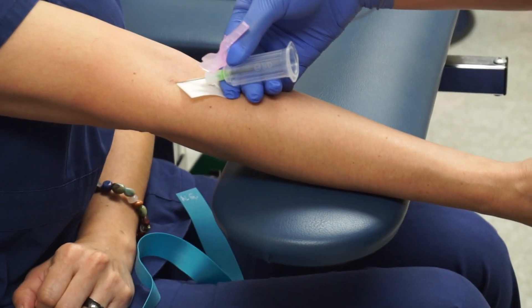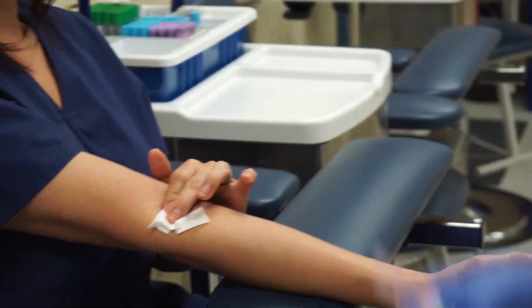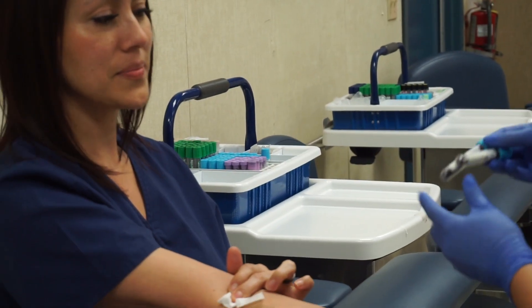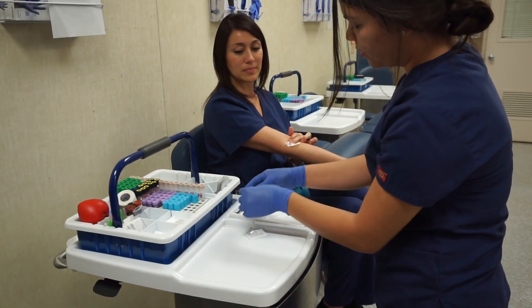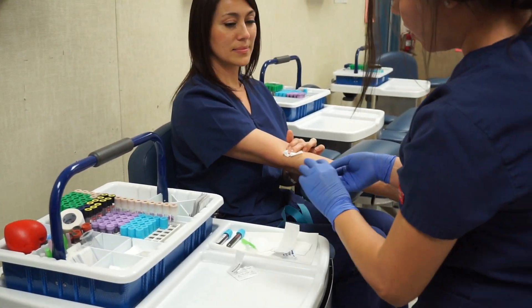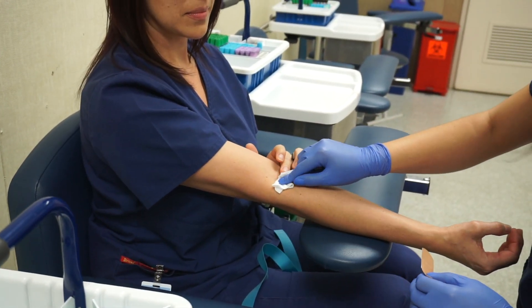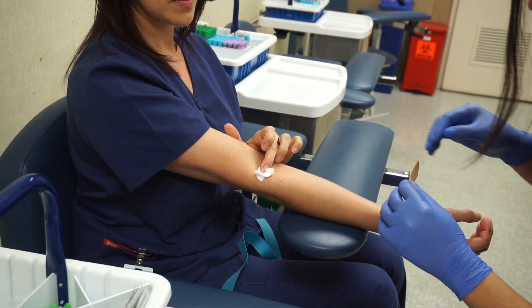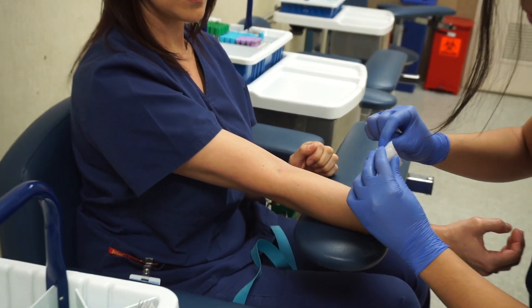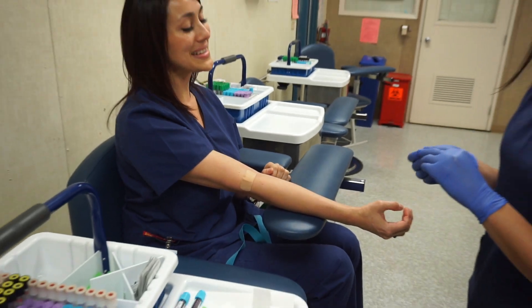Take off your tourniquet — make sure you don't pull out the needle. The patient can open their hand. Pull out the tube. Grab gauze. Make sure not to apply pressure before you take it out. Apply pressure, then lock your needle. Put it in the sharps. Show your patient the label. Then grab your band-aid — it might still be bleeding, so apply pressure first. Put on the band-aid. Remember to ask the patient how they're doing. Are you okay? Yes. And that's it.